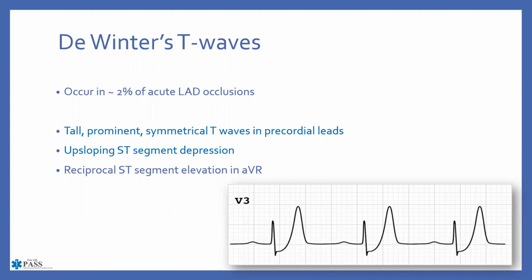If you all remember back to when you first started doing EKGs, or when we were doing axis deviation, we talked about AVR, and AVR from a pre-hospital and from a 12-lead perspective is always kind of the one that is left out. The only thing that we ever really use AVR for is to see if it is heading in a southerly direction.